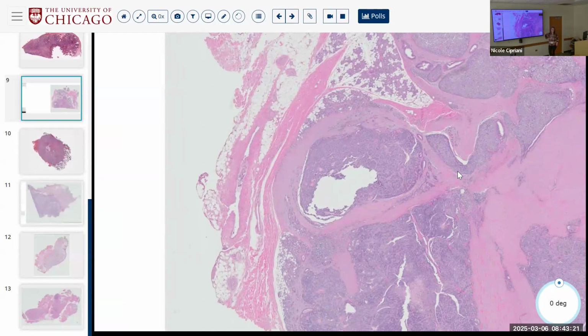Epithelial, myoepithelial carcinoma. Pardon? Epithelial, myoepithelial carcinoma. Wonderful. What else? Basal cell adenocarcinoma. Basal cell adenocarcinoma. Wonderful. Do you have a favorite based on those? The second one, which is basal cell. Okay, you're favoring basal cell adenocarcinoma.